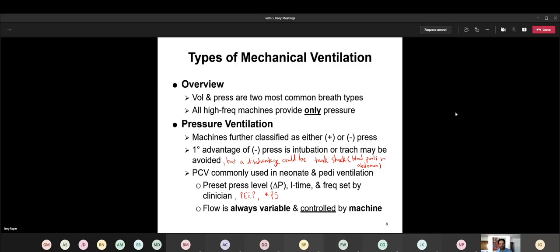still meet your requirements. Your requirements are the delta P, like make sure that the delta P is this, or make sure that the PIP is no more than this. And it will make those adjustments to the flow rate as it needs to ensure that that is your pressure limit, and you're not going to go any higher than that. So if anybody told you that you can set your flow rate directly in pressure control, they're lying to you, because there's just no way.